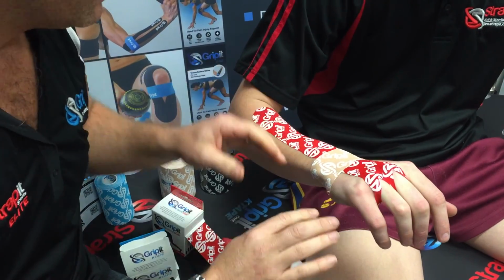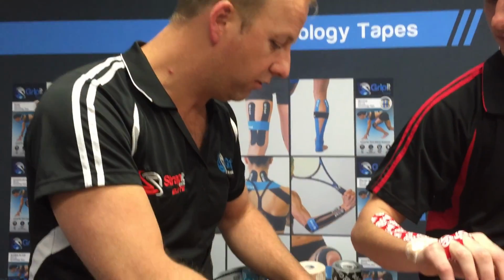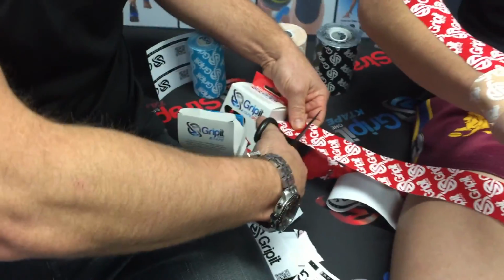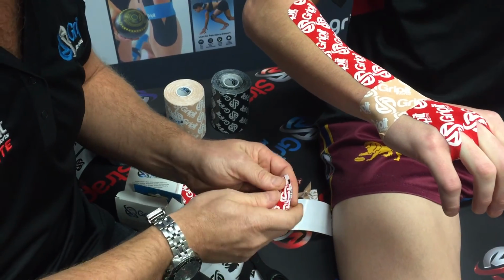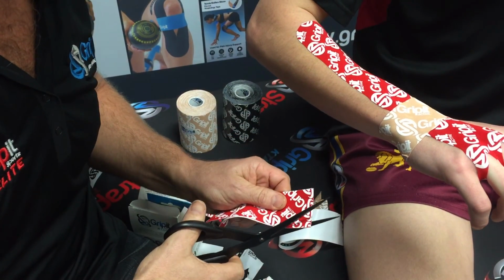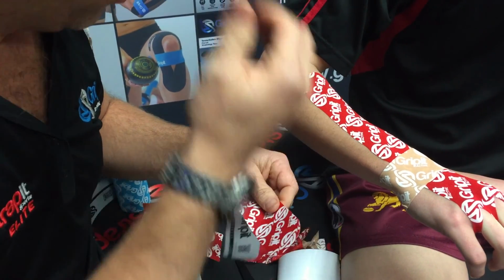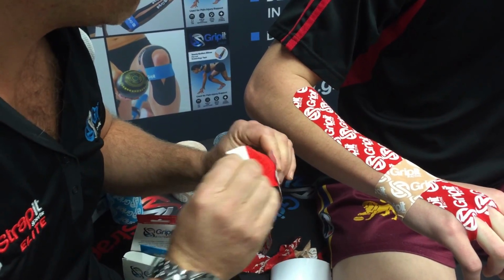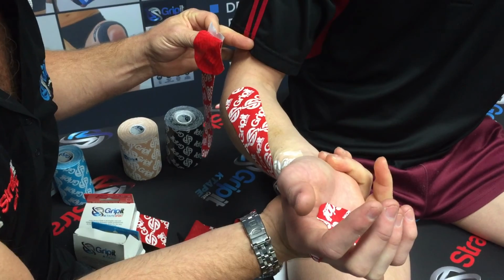So that's really important. Now, that may be all you do for this as a way of deloading the common extensor origin or tendonitis, but let's quickly show you how to then stop a secondary motion, which is called pronation. And so with pronation, we start to sort of get these compression tendinopathies around this radial head. Okay, so we want to try and really, if this is for that real grumbly tendon that just really needs time off when the athlete or the patient is just consistently back at work or back playing and they need to offload that area. Okay, so what we need to do here, we need to put the wrist and the arm into a supinated position. That's it. So you hold that there, mate.